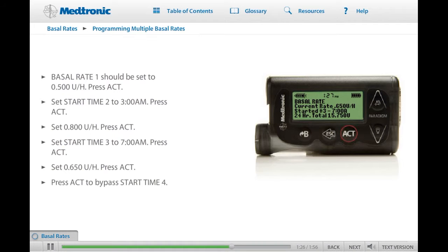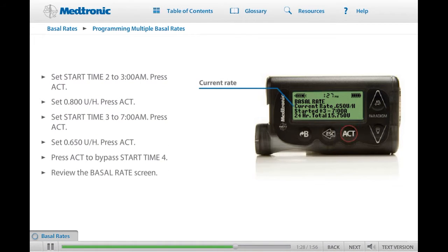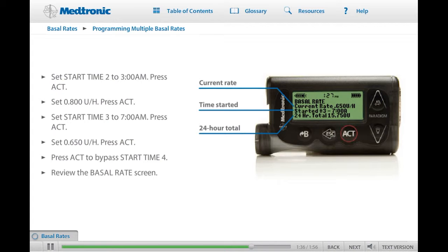Notice that the basal rate screen appears, showing the basal rate that is currently being delivered, the time the current rate started delivering, and the 24-hour total, which in this example is 15.750 units. This is the total amount of basal insulin that will be delivered over 24 hours when the basal rates and times are set using these values. Use your pump to practice setting multiple basal rates now. When you are ready, click Next to continue.